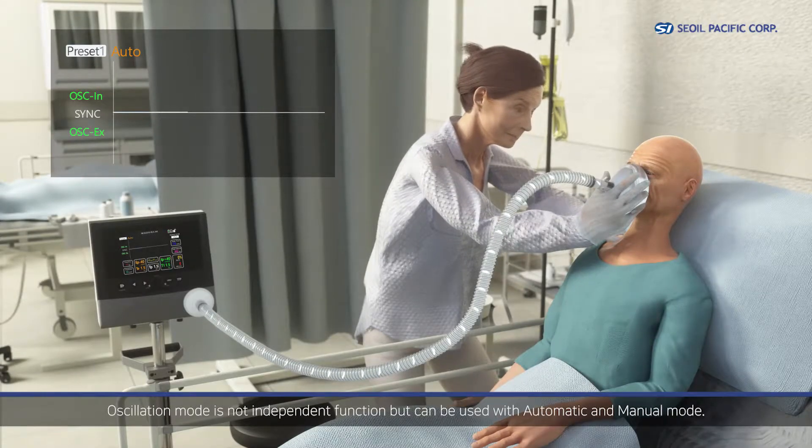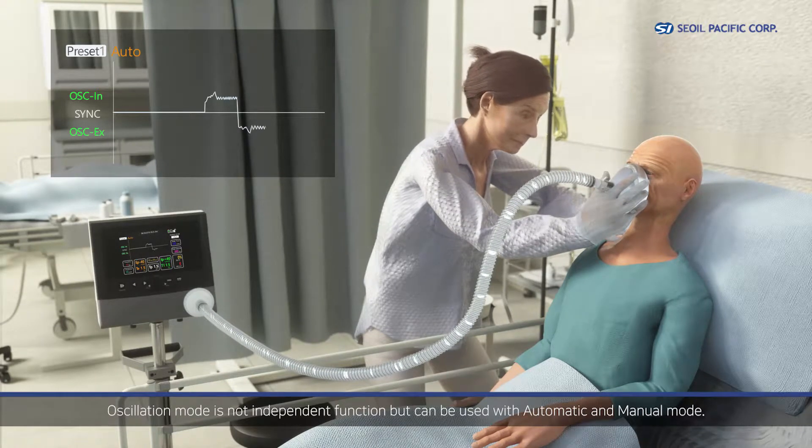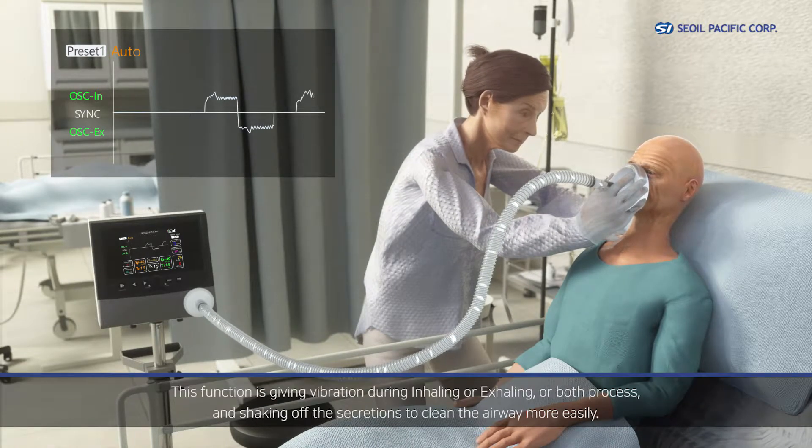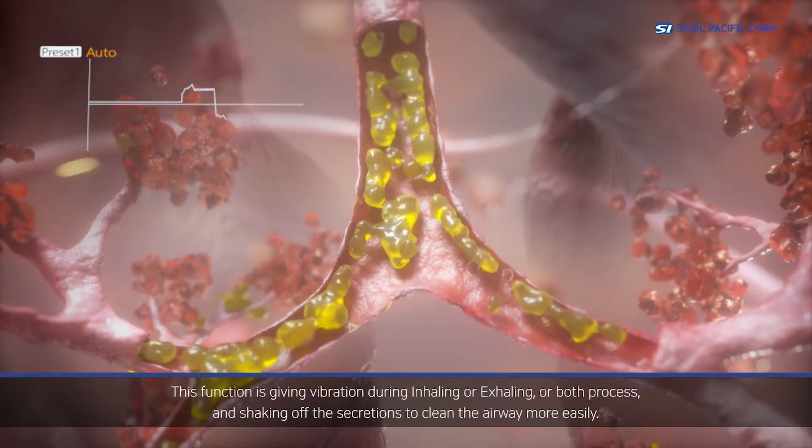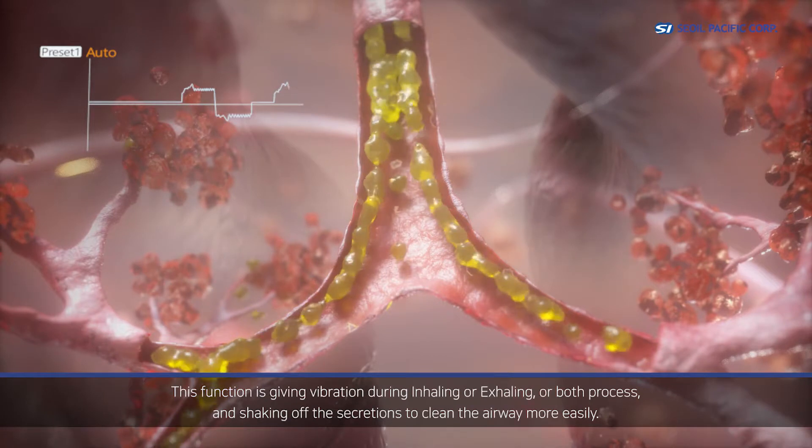To help the caregiver, oscillation mode is not an independent function, but can be used with automatic and manual mode. This function gives vibration during inhaling, exhaling, or both processes, shaking off the secretions to clean the airway more easily.